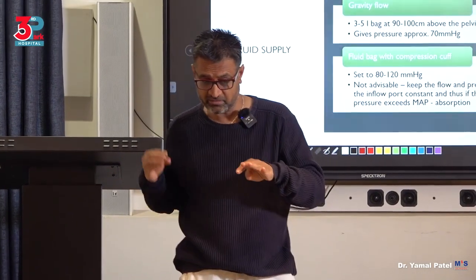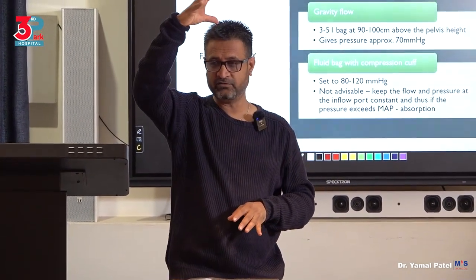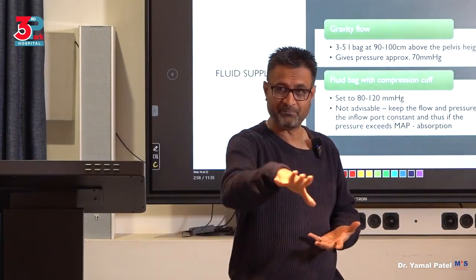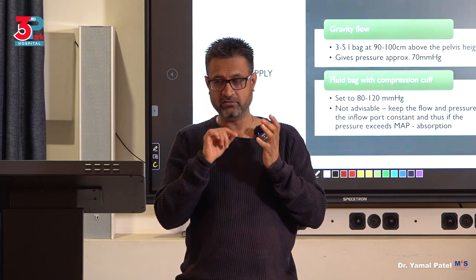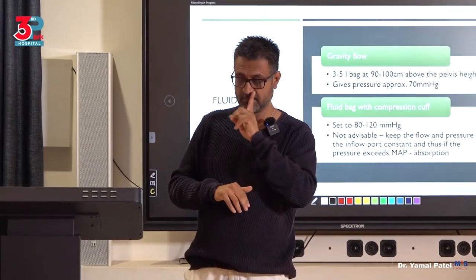If it goes low, more fluid is pumped in. If it goes higher for some reason, because there's a block everywhere and fluid is now just distending, the fluid should stop going in and just allow it that way, because it's already giving you a good view. You've now understood constant pressure, variable flow.